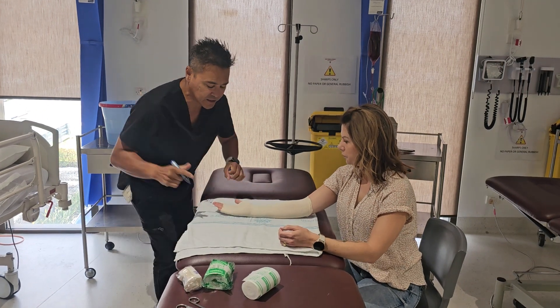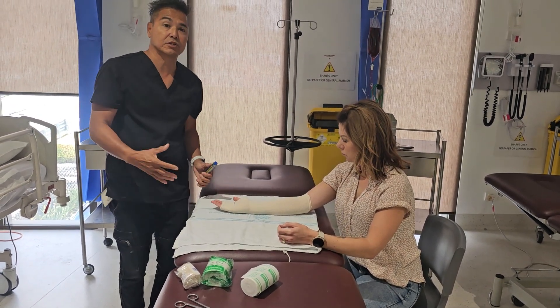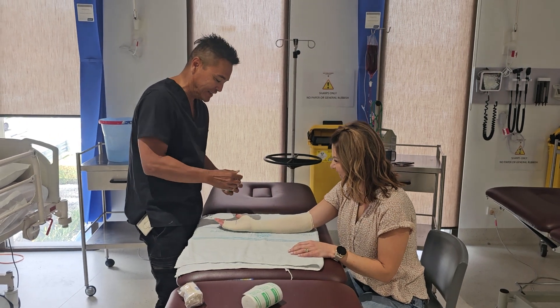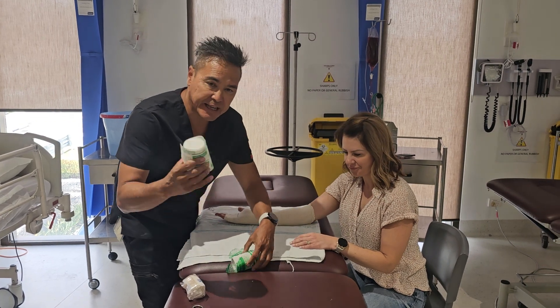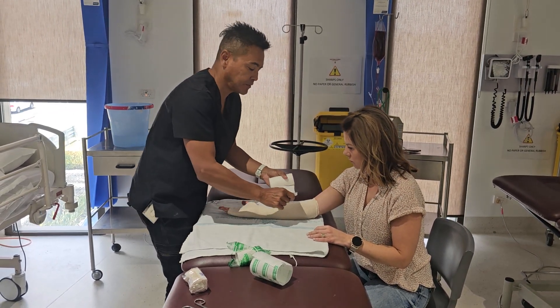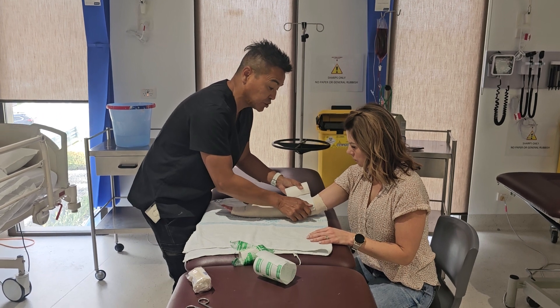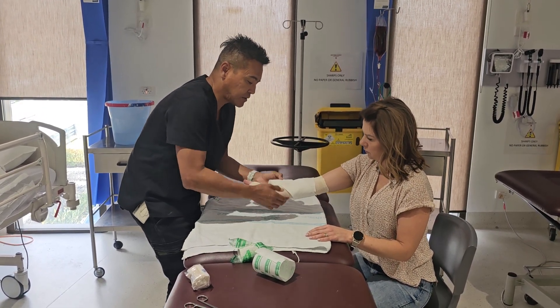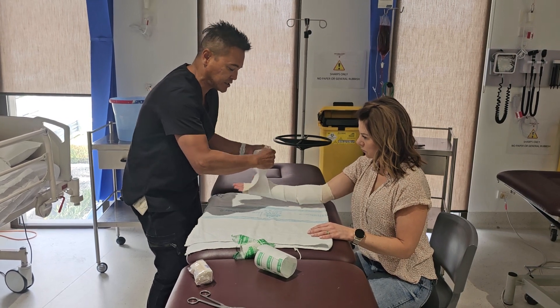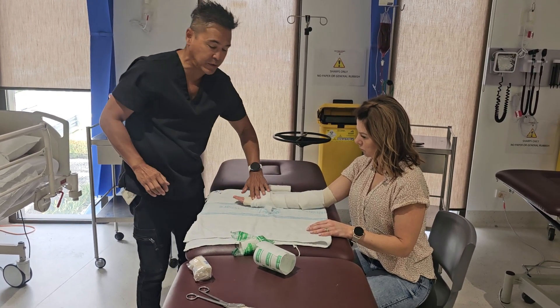I like to give myself a rough idea of where the crease is, and Rachel needs to have her hand in a neutral position when we finish so that she can hold a cup or drink. The next layer is a cotton soft padding — another barrier between the plaster and Rachel's skin. I wrap it shorter than where the stockinette is. This cotton material is very forgiving; you can customize it, tear it, and wrap it around the thumb as needed.